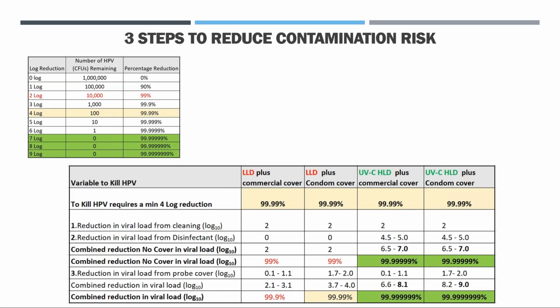Keep in mind that, of course, patients who would be infected with HPV, you're almost certainly never going to know about. This is a hidden epidemic because they won't be picked up for months or years until somebody does a test for HPV, or they develop a cancer that was HPV related.